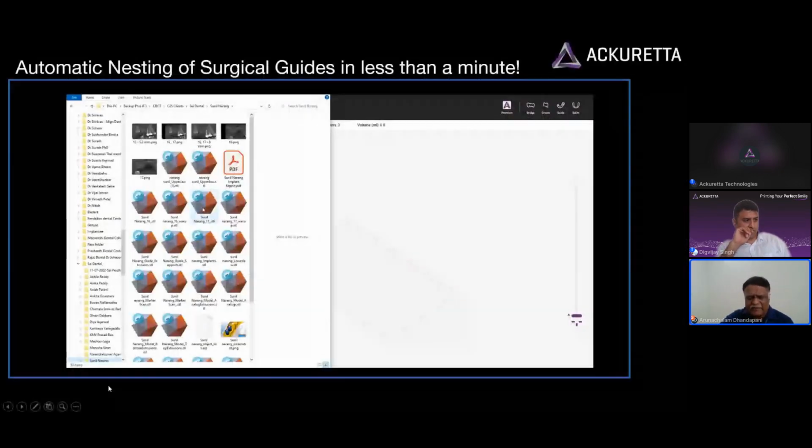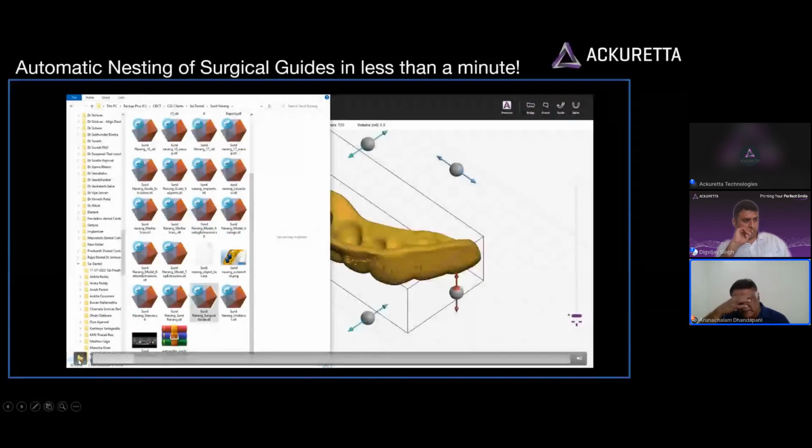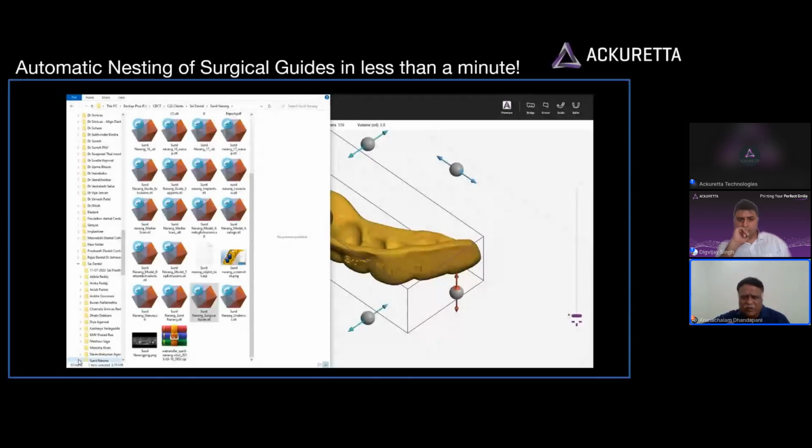And one of the key factors in converting this digital information into real world information is your ability to slice the data perfectly for additive manufacture, and also your ability to orient the manner in which the printing is going to take place, the type of supports that you require, and the parameters that are relevant to that particular resin and so on.